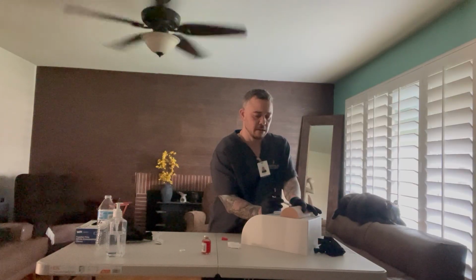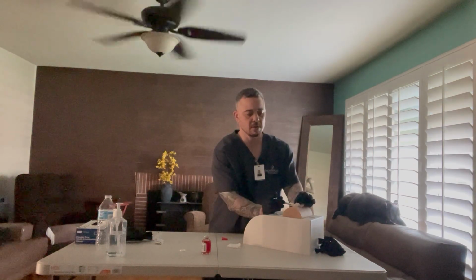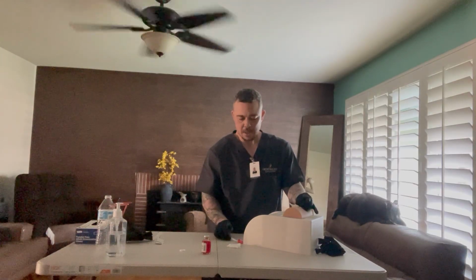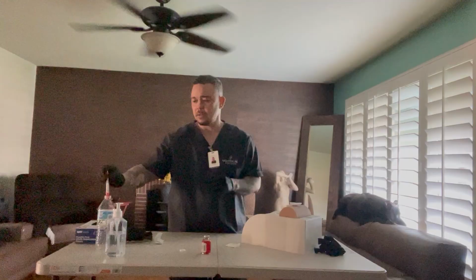Okay. And once I do that, I'm going to get a piece of gauze, lay the gauze down, take out my needle, and do my swoop. Okay, and leave that there. And then I'm going to make sure that I throw my needle into my needle receptacle.